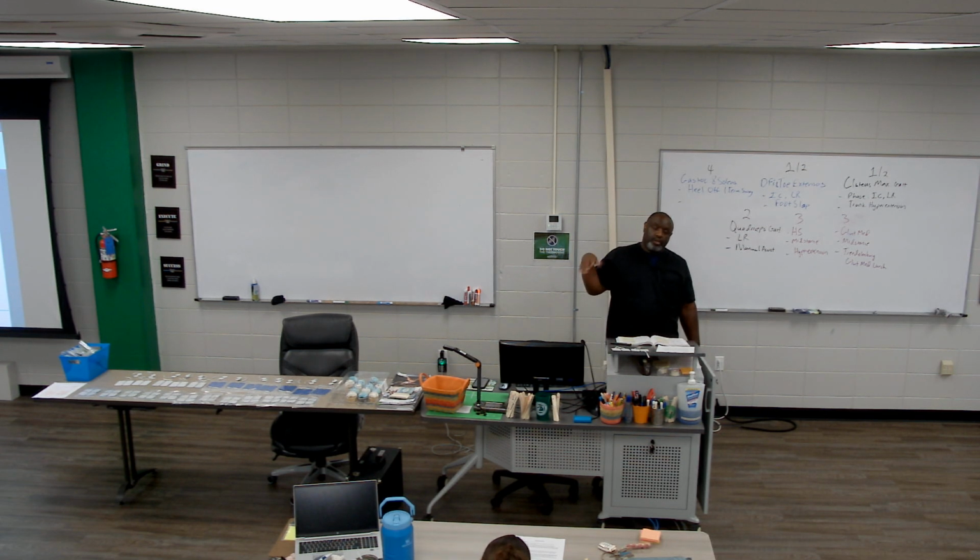So you'll see twitch looking like that when we start to set the device. You'll see the arm looking like this. You're like, ooh, something's wrong with my arm. But that's twitch. Non-functional contractions of an area.